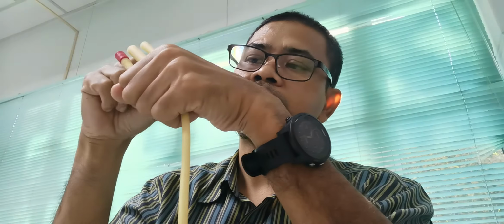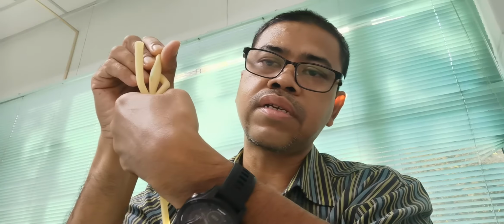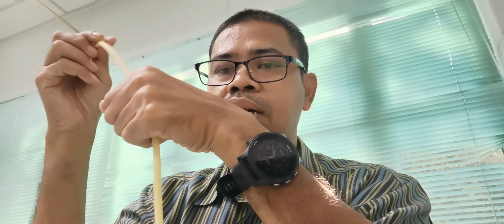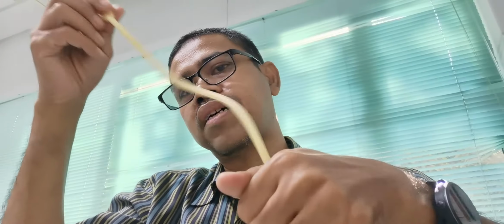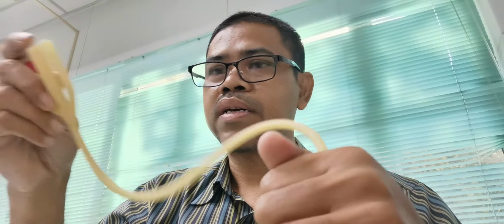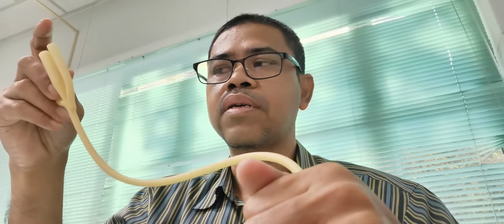After you insert the water for injection, according to the volume like 10, 15 or 20 cc written here, you pull the catheter until it snaps. Okay, until it snaps. Then connect the tip to the bag. Alright, that is the procedure.